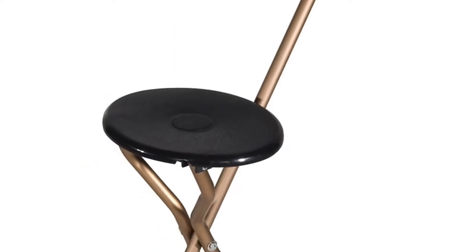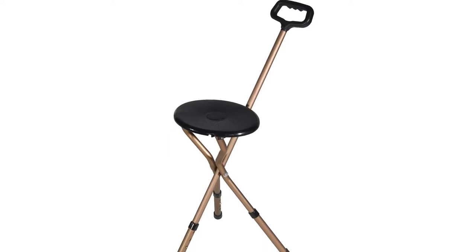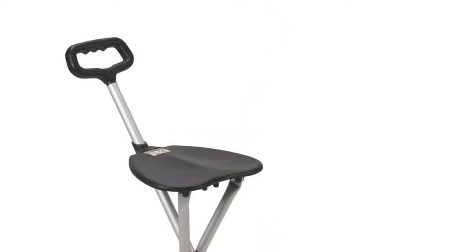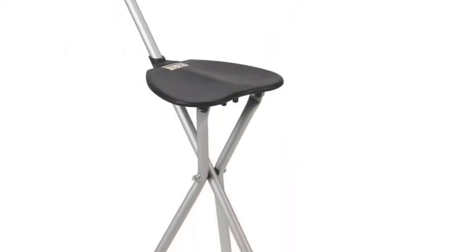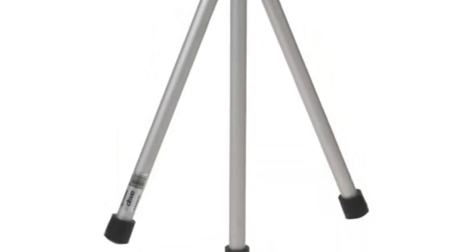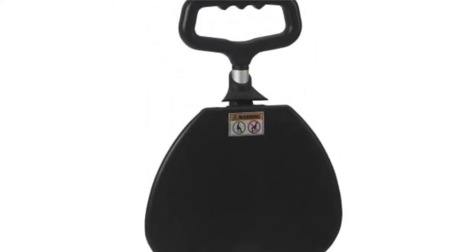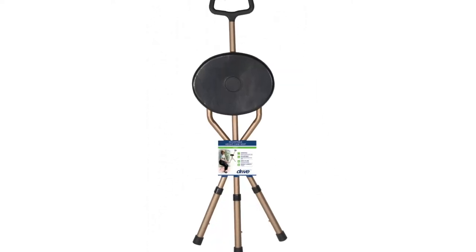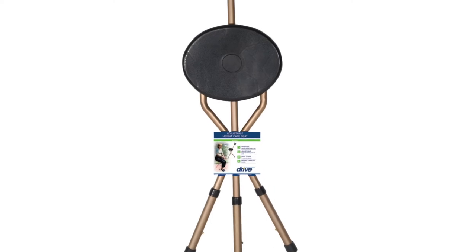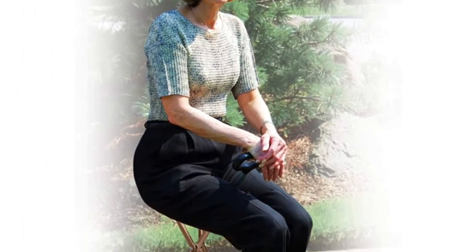The Drive Medical RTL10 136580J is great to take along with you to trade fairs or events that require waiting in lines, when traveling, or shopping. It can also serve as a nice gift for elders. It comes in a 34x12x2.7 inch frame and weighs 3.31 pounds.